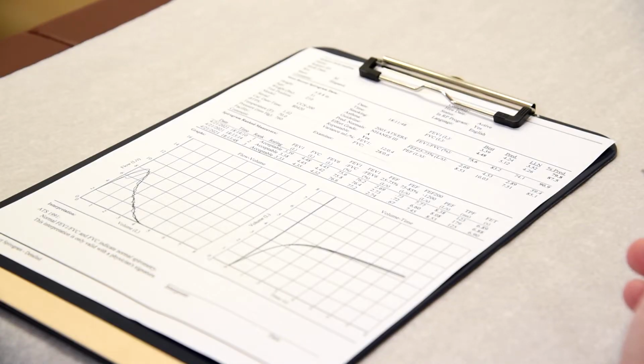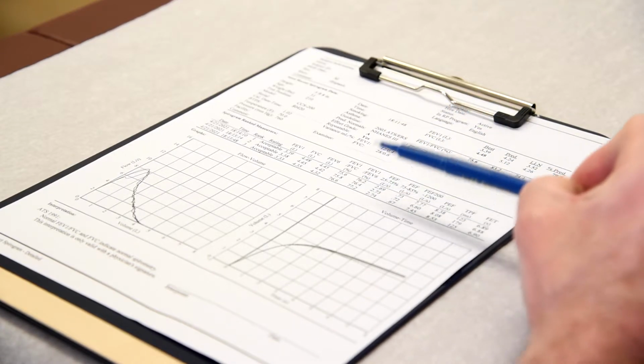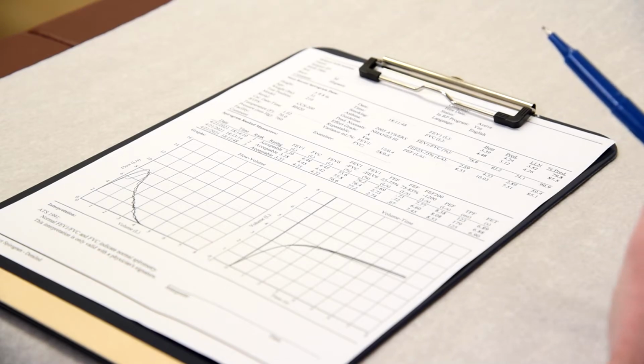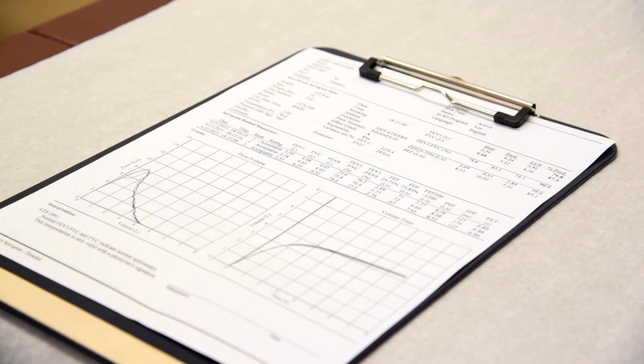Once the spirometry test is completed, the technician will bring to you the results. As you can see, this is an example result that I have removed the patient information from to give you an example. A few things that you would focus in on is the patient's effort.